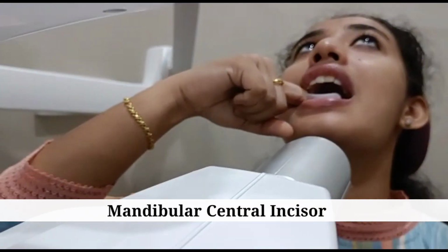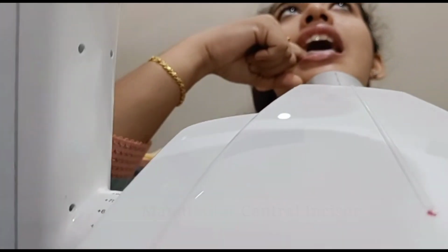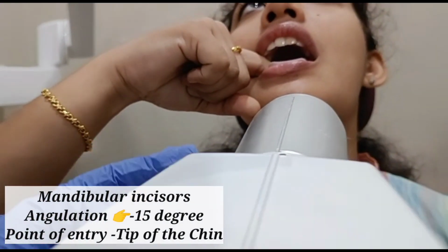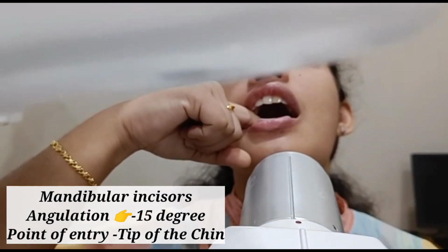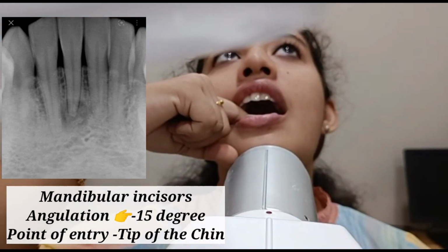Now we are trying to position the X-ray tube head, and we are giving a vertical angulation of -15 in such a way that the central ray of the X-ray is directed towards the tip of the chin. So this is how we take the mandibular central incisor projection.